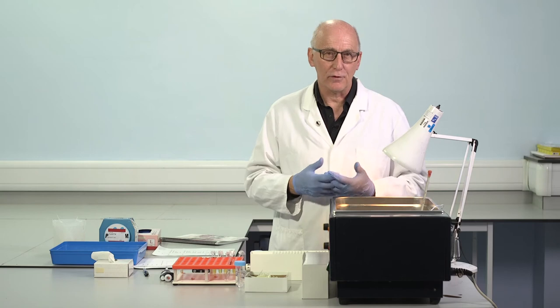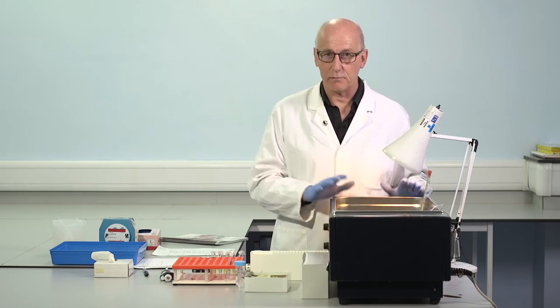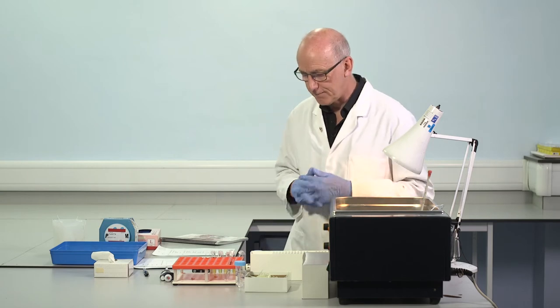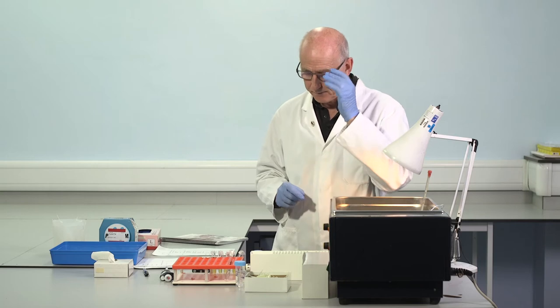Okay, so we have our control result. We're content that it's within the target. It means the water bath temperature is adequate. It means the reagents are behaving in the expected way. So we're able to proceed with patient tests. I'm going to set the next test running, and then I'm going to talk about the tilting of the tubes.